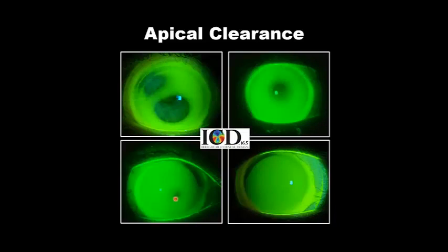Here we see a keratoconic patient with just the faintest hint of where the cone is. If we let that lens settle over the course of the day, will that settle into touch? It might be worth putting an extra 100 or 200 microns on if this is a trial lens and see how it settles and whether it settles into touch. If we have inadequate clearance to start with in the initial lens, then you may not have enough after it settles. This is the kind of thing we're looking for, a lens that definitely is clearing corneal tissue.